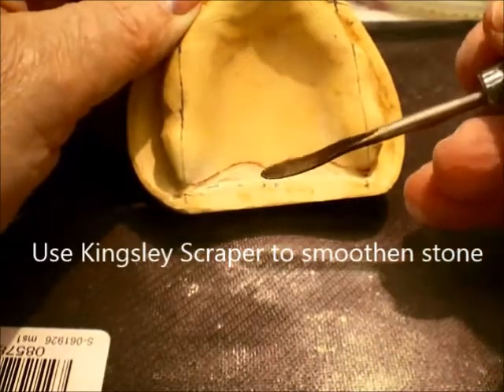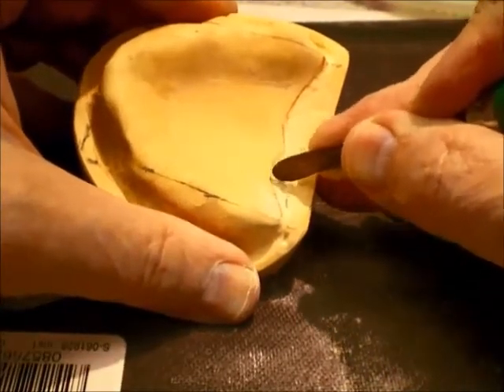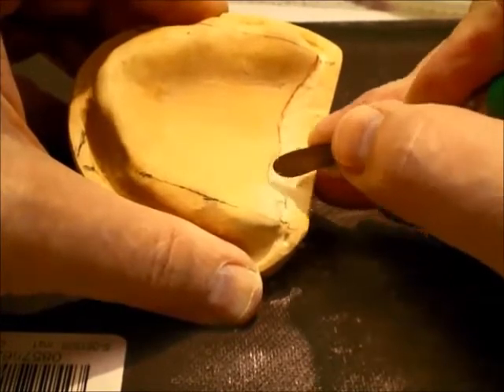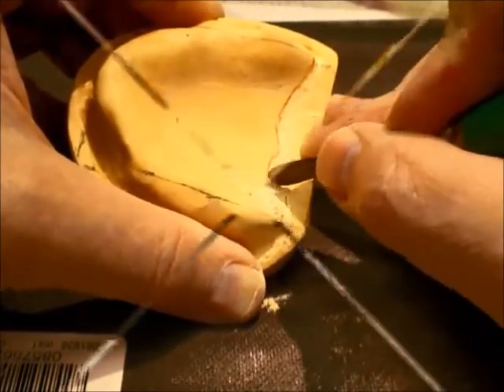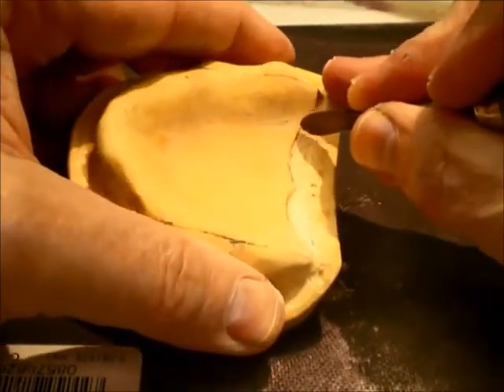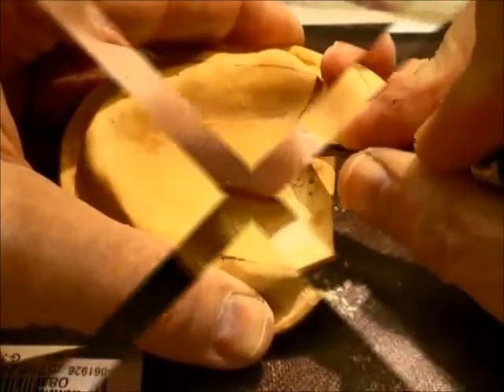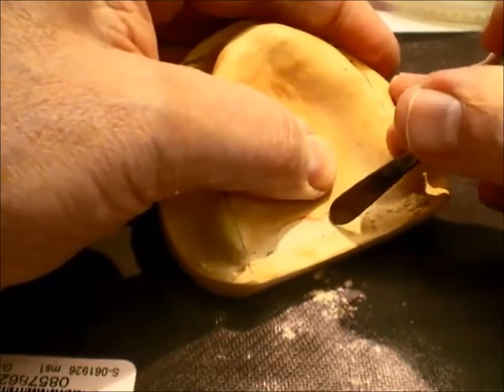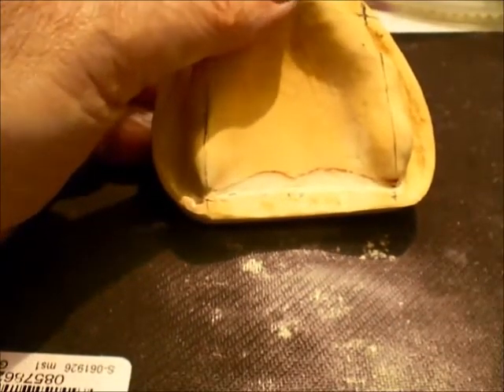A Kingsley scraper is then used to smoothen the stone, tapering, feathering, smoothening, and deepening as you go along. A repetitive light motion will burnish the plaster and give you a nice smooth result. Work out all the nicks and scratches and lumps and bumps until you have a nice, well-burnished smooth surface.